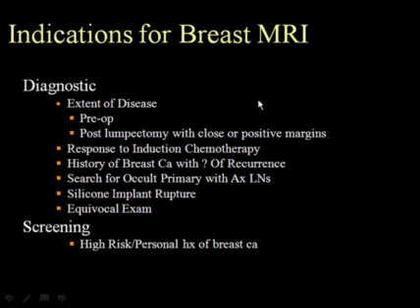Indications for breast MRI, there are several, but specifically the diagnostic arena is for extent of disease. And what that means is patients that just got diagnosed with breast cancer, and before they go to surgery, you want to really help the surgeon plan out the surgical approach and want to measure the lesion in more than just the mammogram or ultrasound, and these are extent of disease. You also want to do this preoperatively. It's much easier to look for extent of disease prior to any surgical intervention, because surgery causes a lot of changes and that makes it a bit difficult.